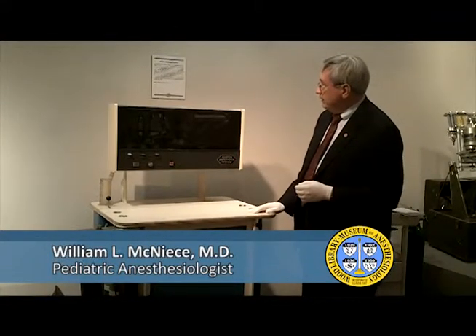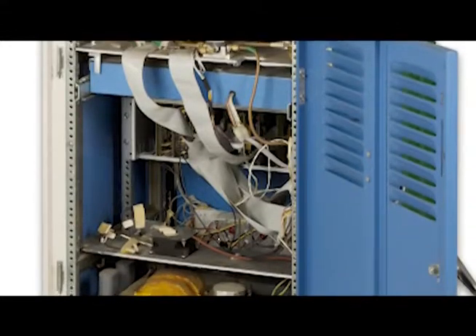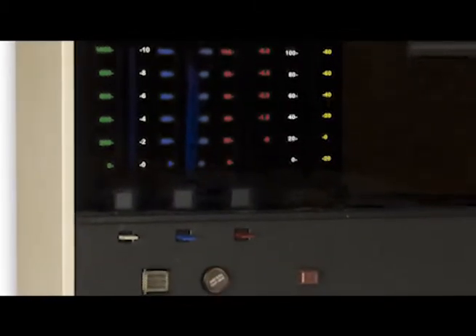It's based on an 8-bit Intel 8080 microprocessor chip, and it uses that for a series of computerized functions, including electronic display, gas flow, liquid anesthetic measurement, and safety alarms. This machine then becomes a prototype for technology that enters commercial anesthesiology available by the late 1980s.